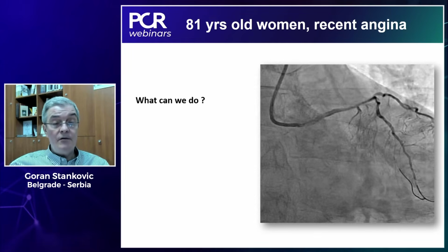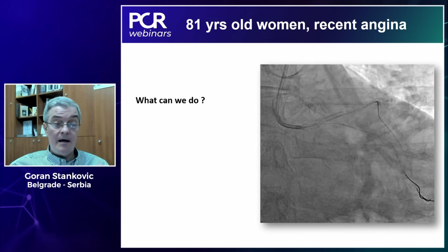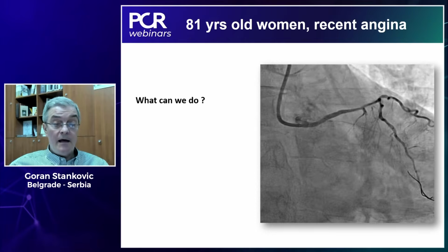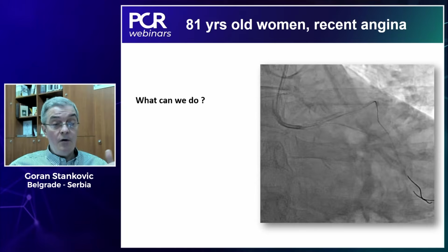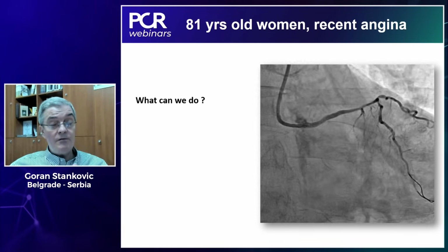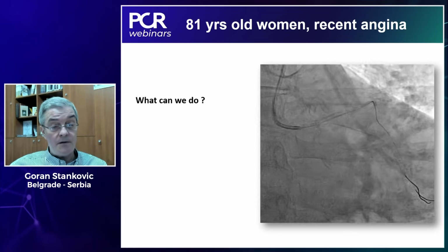If POT does not work, because of the discrepancy in diameter between the left main and the ostium of the LAD and circ, there is always the possibility to go with a small balloon on the jailed wire behind the stent and re-establish flow, sometimes just by passing the balloon, even without inflation.